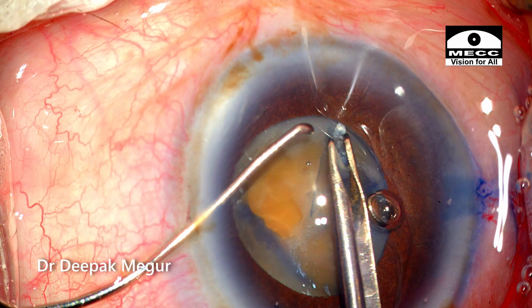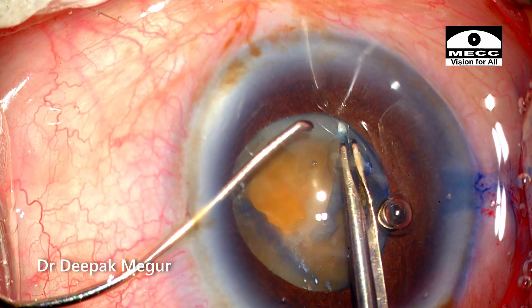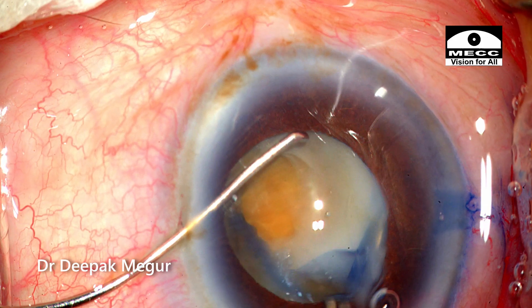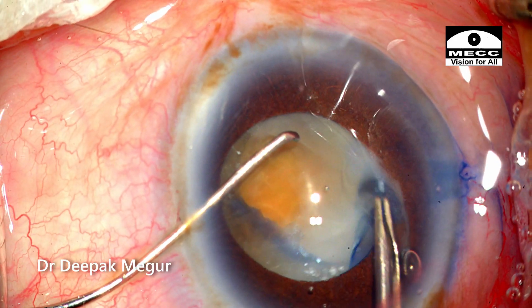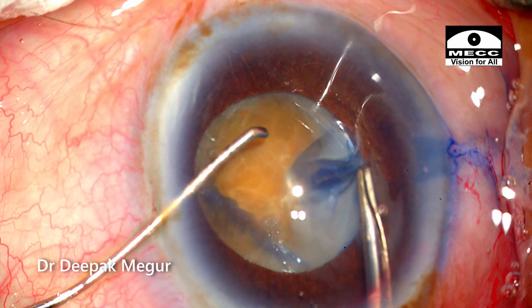This part of the capsule is tricky. The capsular tear is becoming eccentric and large — it might just extend out. So I just stop there, change the direction, and complete the rhexis from the other end.